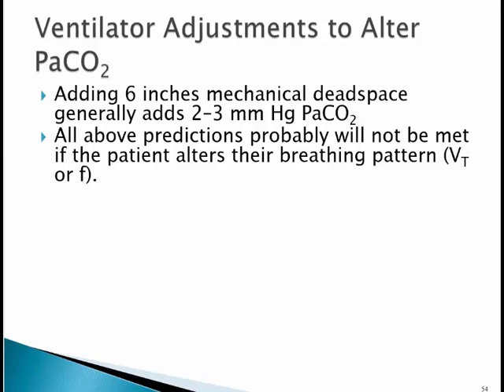So what happens here is you can actually change the CO2 while not changing the FiO2. So your oxygenation is going to remain constant, but you're going to actually be able to change the PaCO2. Now, in addition, you need to be concerned about, does the patient have dead space?